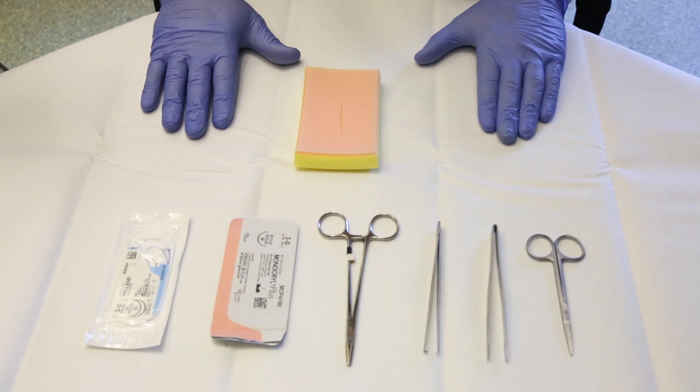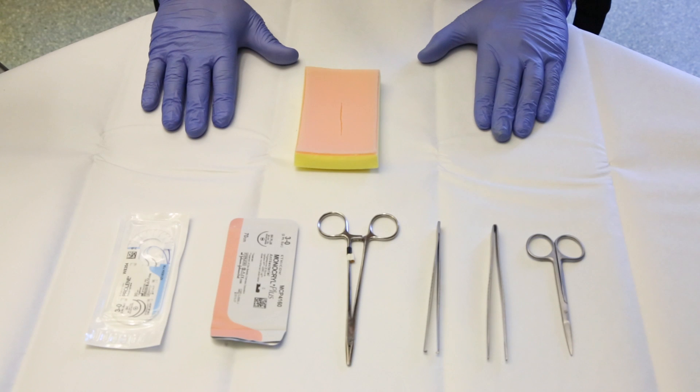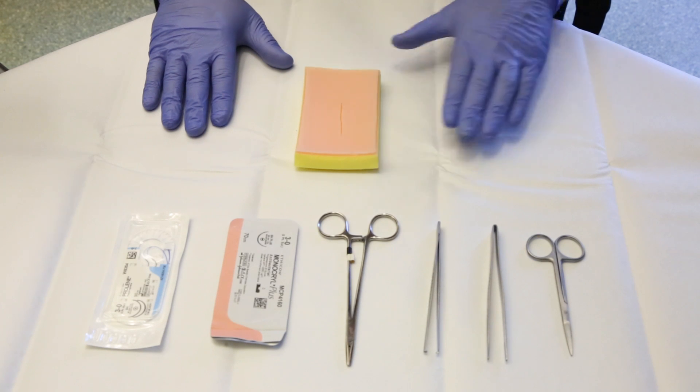This is to demonstrate how we do a simple interrupted surgical stitch. First of all, we want to know what instruments we need to do that procedure.